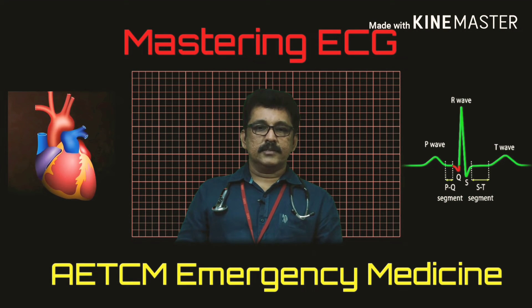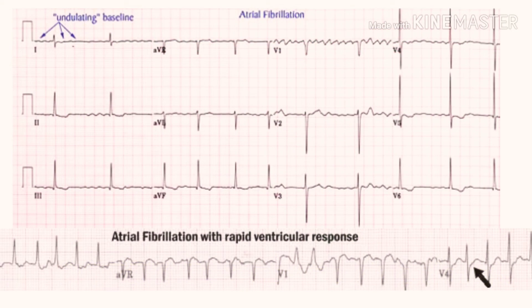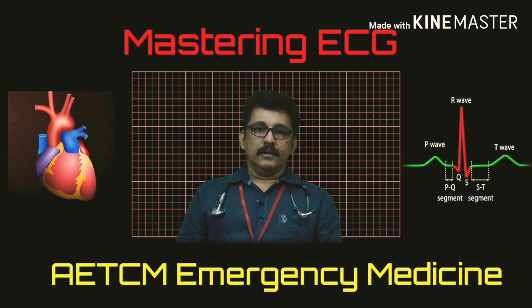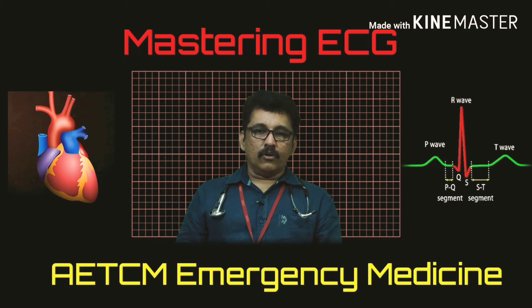In this ECG, the lower part shows a rapid heartbeat with irregularly irregular QRS complexes — that is atrial fibrillation with rapid ventricular rate. The upper part shows controlled rate atrial fibrillation with irregular but controlled QRS complexes. Atrial fibrillation can be diagnosed as irregular narrow complex QRS tachycardia.